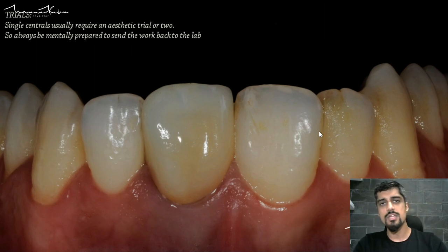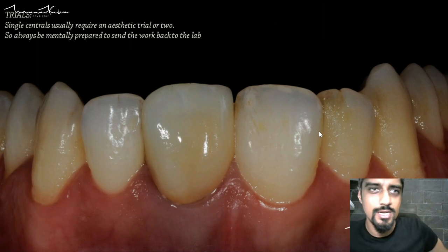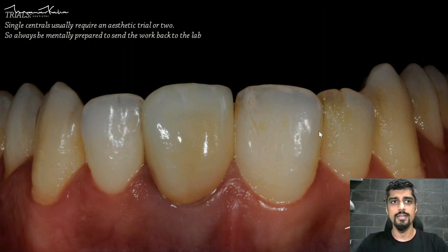Whenever the restoration comes back from the lab, we just get excited that our case is complete and we're going to get paid. But that is not how I look at it and that's not how you should be looking at it. You should always consider that when the restoration has come back from the lab, that is your trial appointment — this is called an aesthetic trial. I have simply gone straight ahead for the aesthetic trial, which means the restoration comes back with the final glaze and staining.